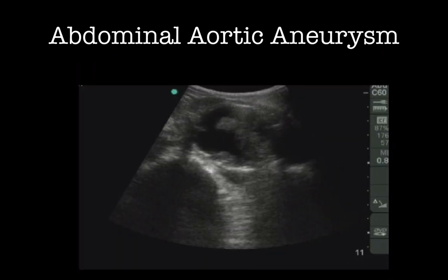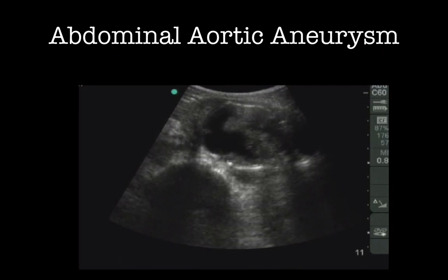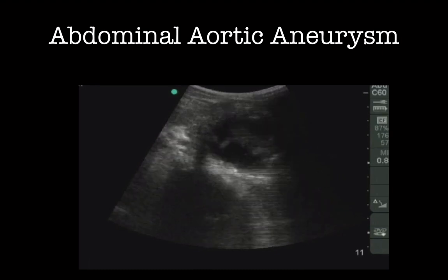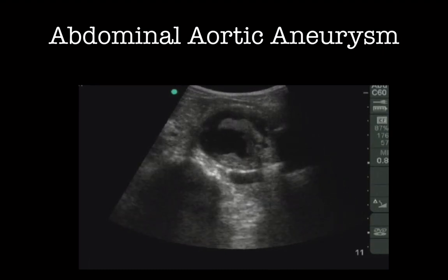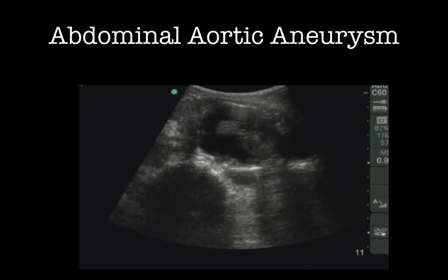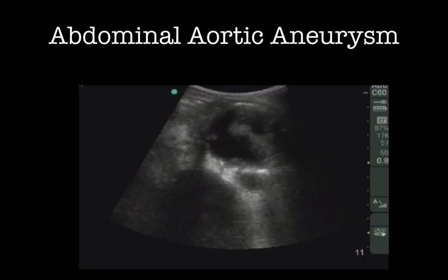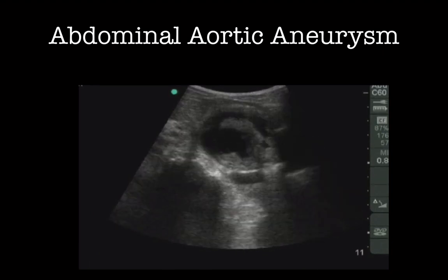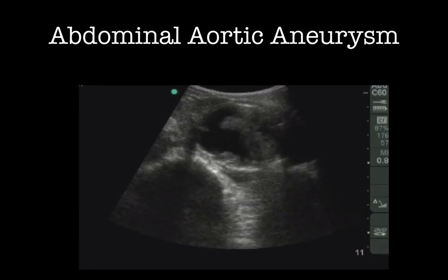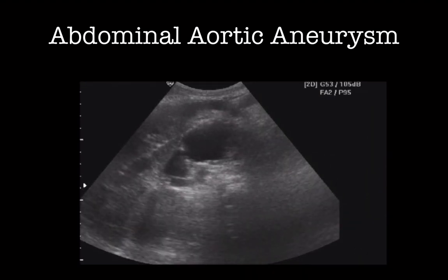You can see the clot is pulsating. This is here to remind me to tell you that little bits of this clot can break off, and where would they go? They would go distally. So if you see somebody with a blue toe, you can think peripheral vascular disease, but don't forget about the aorta. Maybe they have a dilated aorta and they're throwing emboli from that clotted blood from the abnormal flow in the aorta. Here's a ruptured abdominal aortic aneurysm.